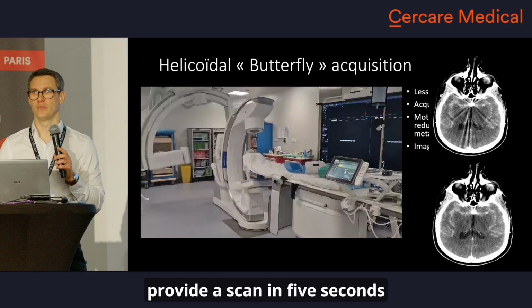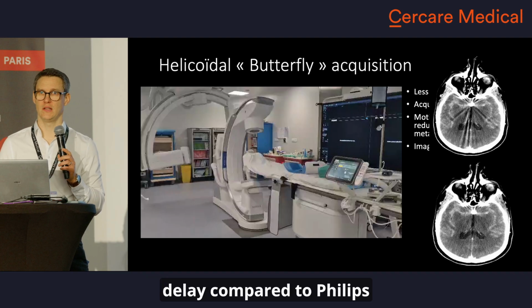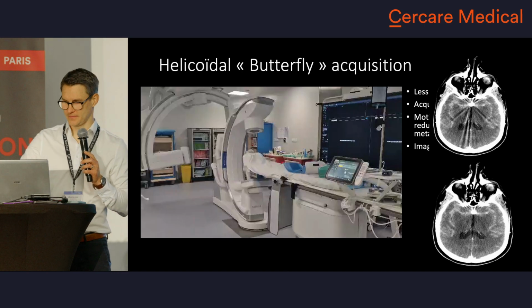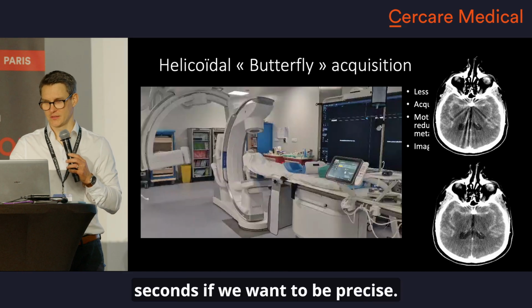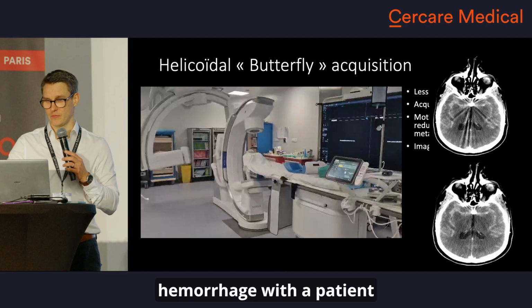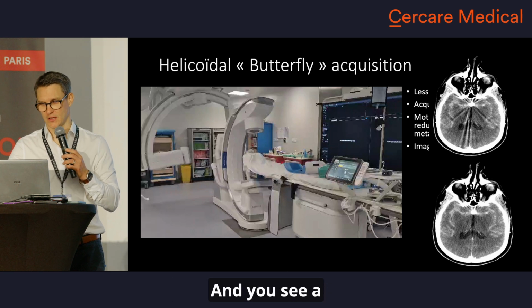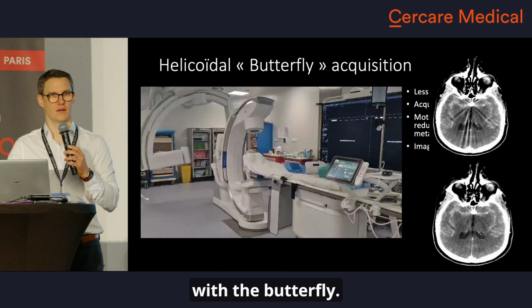Siemens is capable of providing a scan in 5 seconds with a very, very much shorter delay compared to Philips to start another scan. But at least, yes, 7.8 seconds if we want to be precise. And we got a really better quality here. It's a subarachnoid hemorrhage with a patient with coils in the anterior communicating artery, and you see a conventional CBCT and a CBCT with the butterfly.